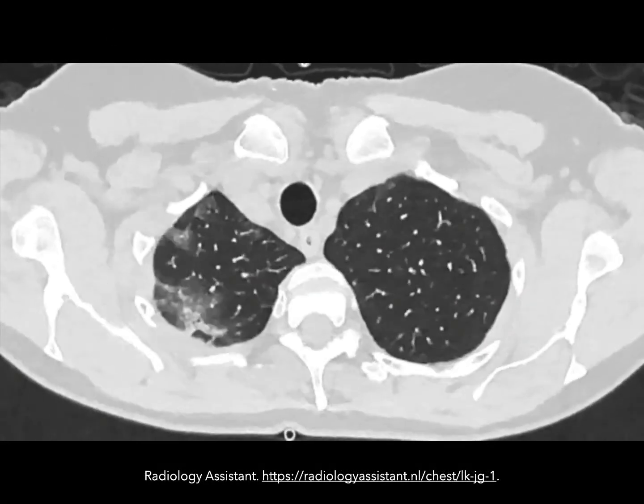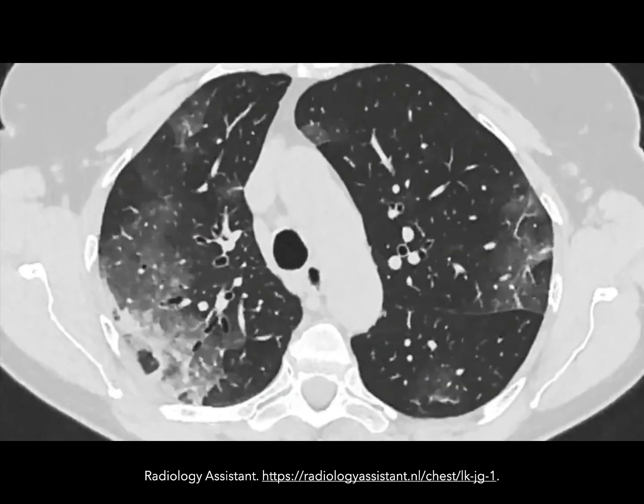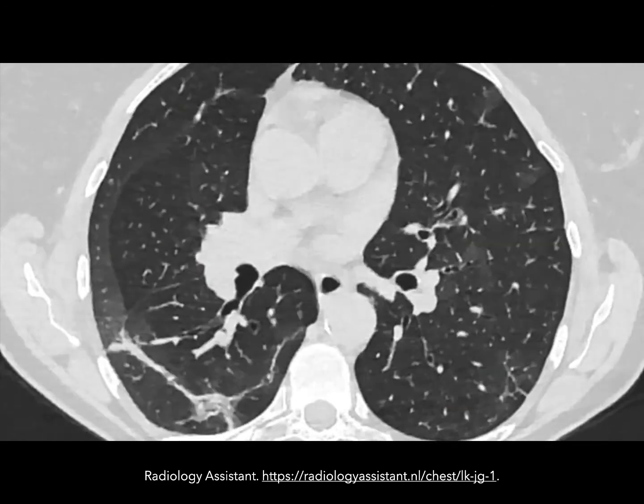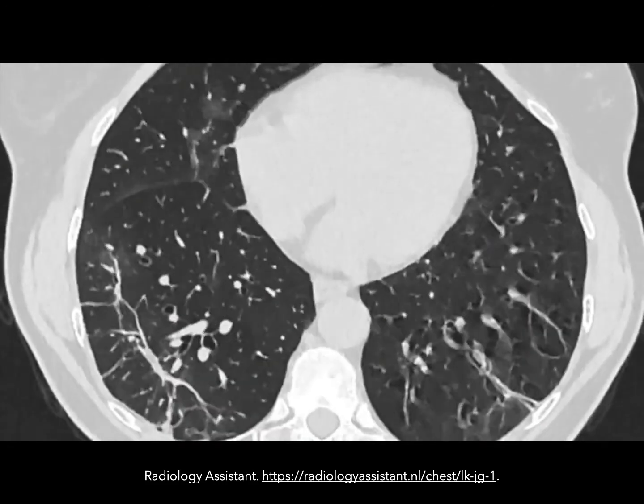So here's an example of a CT of a patient with COVID, and we can see a couple of characteristics here. We can see that there's bilateral lung involvement, there's a mix of ground glass opacities and denser consolidation, and the lesions are mostly peripherally based.